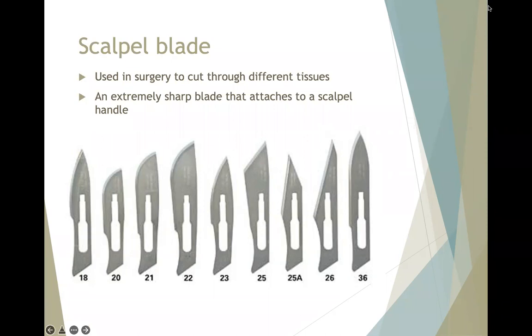And this is really important to know because as an assistant, cleaning up after surgery and turning the surgical suite over is a large portion of our job if you work in surgery. And of course, as you're cleaning up, we need to know how and where we dispose of these instruments, the ones that are one-time use only, which are going to be our scalpel blades, sutures, different needles, and of course, anything sharp is going to go in the sharps container.